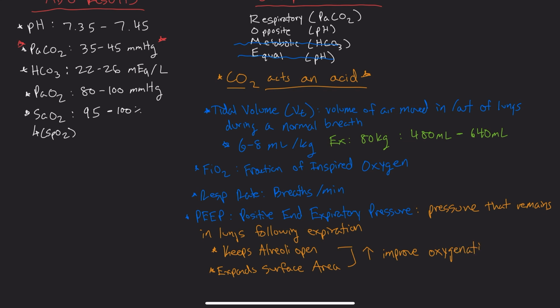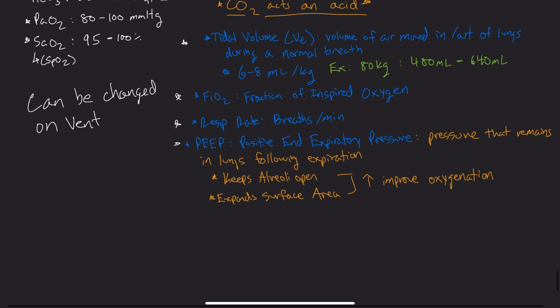Okay, so these 4 in blue here, these are all settings that we can change on the vent. So that's why it's important to know those, understand what they are before we get into it. Okay, so now let's go ahead and get into it.